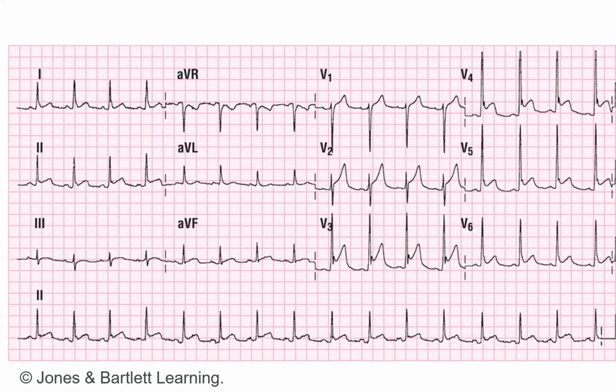What kind of STEMI are you telling me we have? Septal, anterior, lateral. Can you have that? Yes, but it's probably not one. What are we looking for? Well, remember there was some elevation in II, and you have elevation in the laterals. Do we see elevation in inferior and lateral leads at the same time normally? No, they're reciprocal. We should not see them in the same direction, which means this is most likely a STEMI mimic. Lateral and inferior?